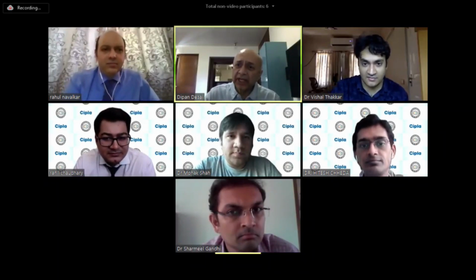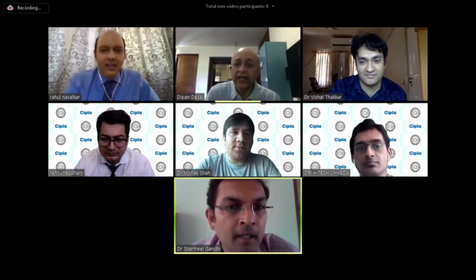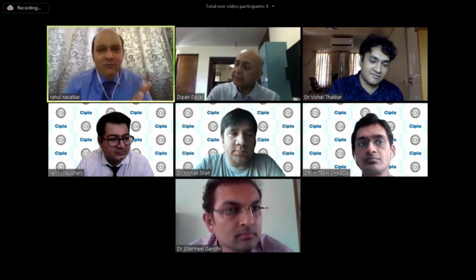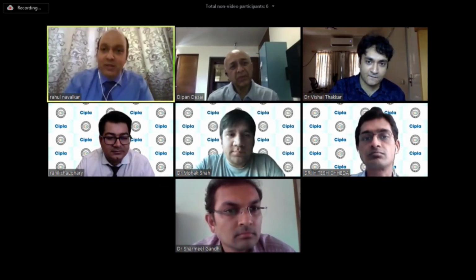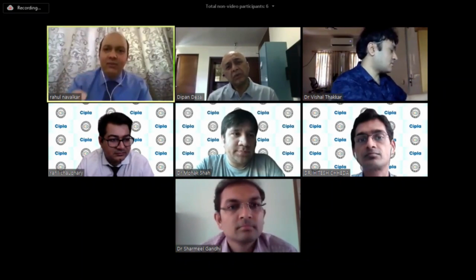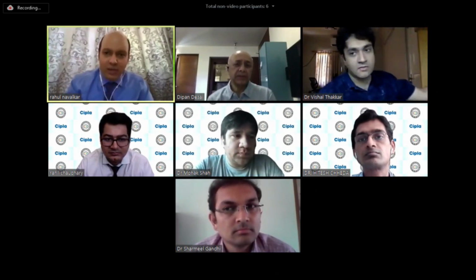But you require the machine, I guess, a Varion or a Callisto. Over here, I think only Vishal has it. I have Varion, but we aren't doing it. Yes, sure. I think the toric lens I use is a bit forgiving. So 2 to 5 degrees is not really going to make too much of a difference. But with the Femto, I really like that aspect of those markers. Excellent, because I don't think that really weakens the rhexis in any way, and it places the most accurate marks, and that would be one of the top uses of Femto cataract, I would feel.